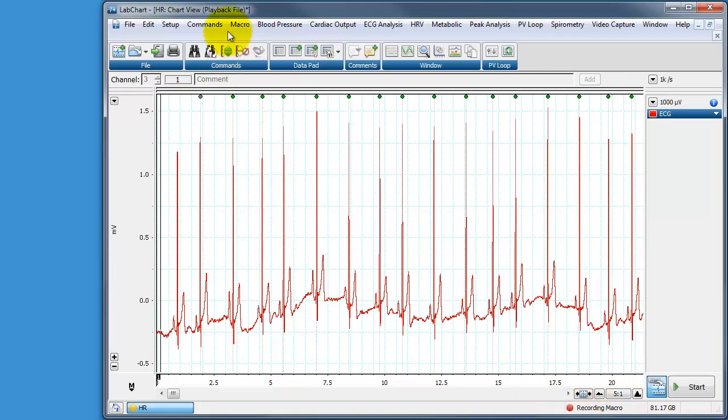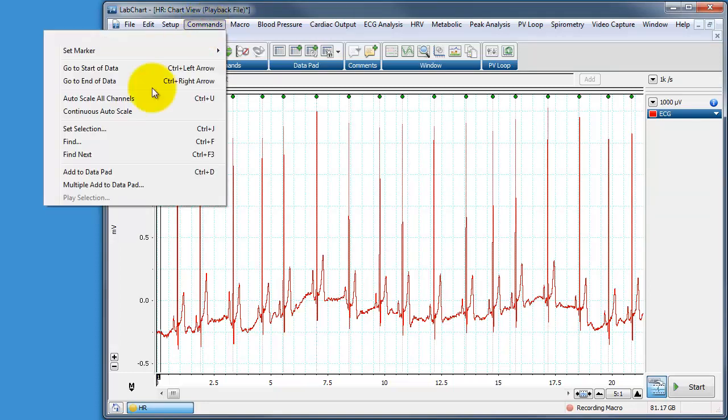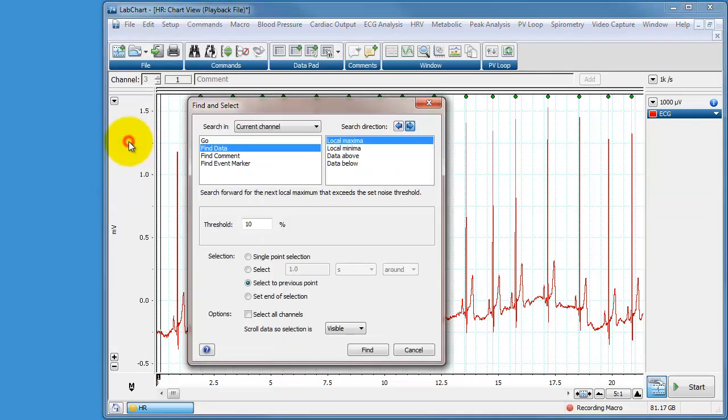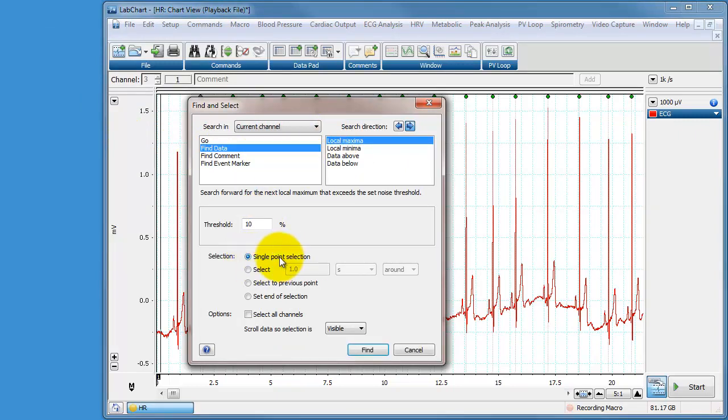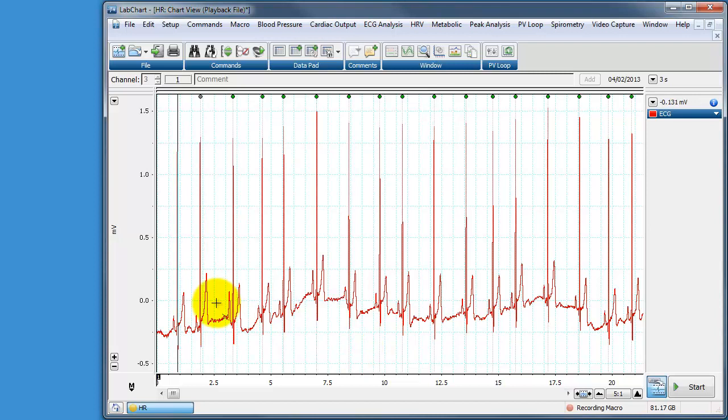So we're starting to record our macro and everything we click on, select and do from now on is recorded in the macro. So we'll go to commands, find, find our local maxima at 10% height and we're going to do a single point selection and find it. So now we've found the first R wave.